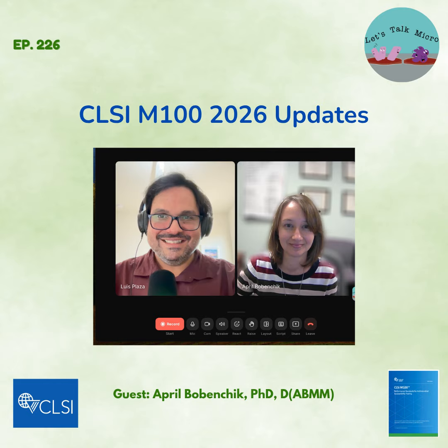Yeah. Okay. And a little side note for the audience, we're talking about disk diffusion and something came to mind. In the lab, it's very typical that we have the stampers, where we can put several discs on the medium. One of the things that's very frustrating as a tech working the bench is when you're going to stamp and nothing comes out or only half of them come out.